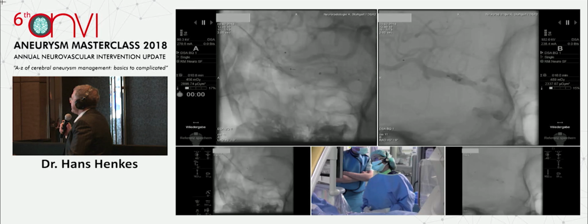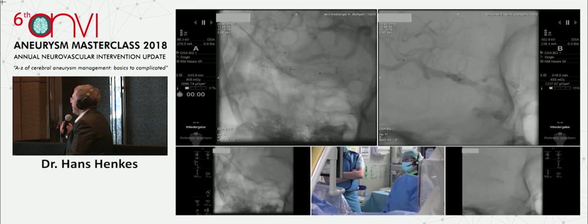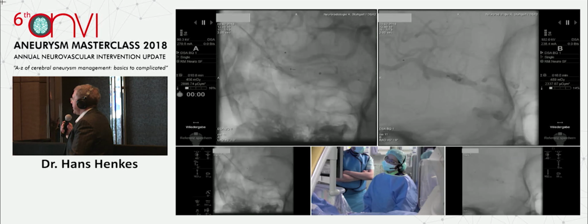Uncovered, okay. Or it's at least at the border, and the reason is that she thinks that the microcatheter, the XT27, probably straightened the distal M1 segment a little, and with this straightening there was a kind of misalignment of the implant while deploying.